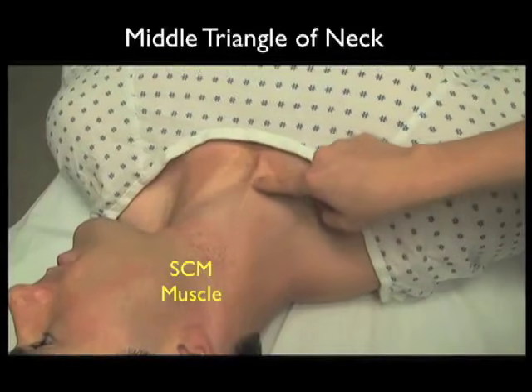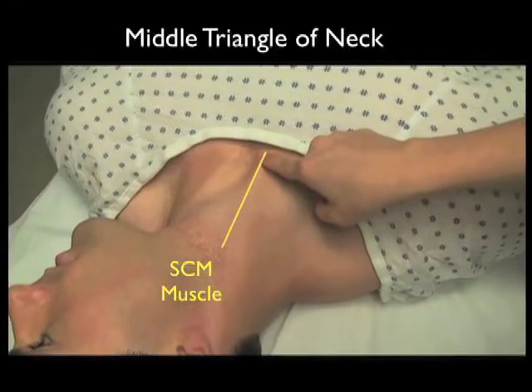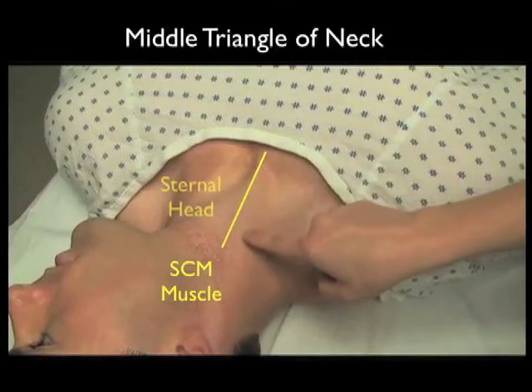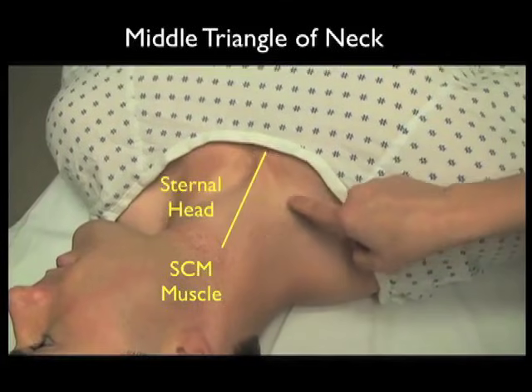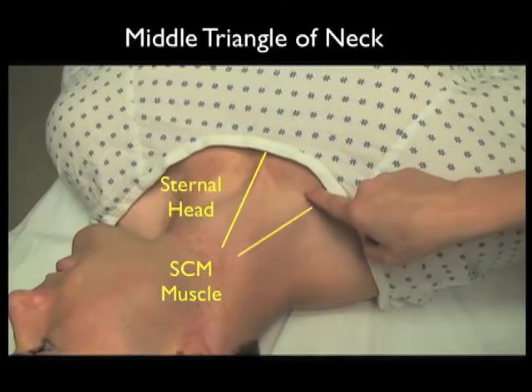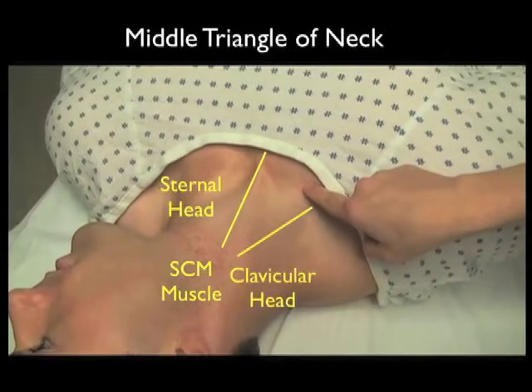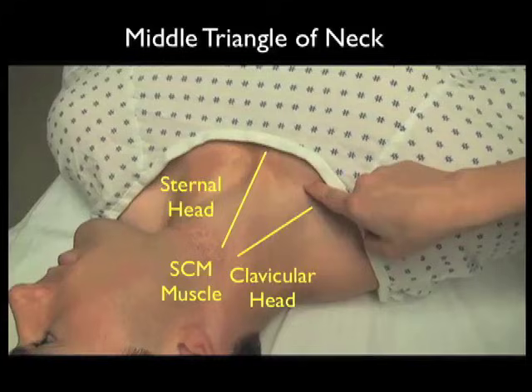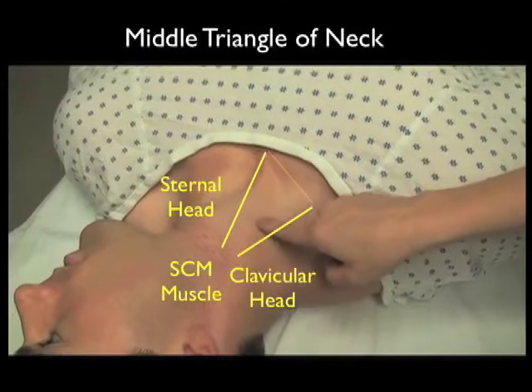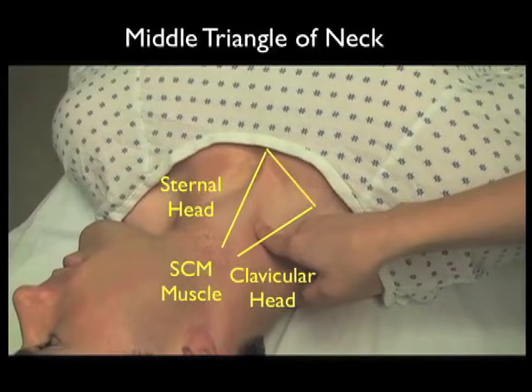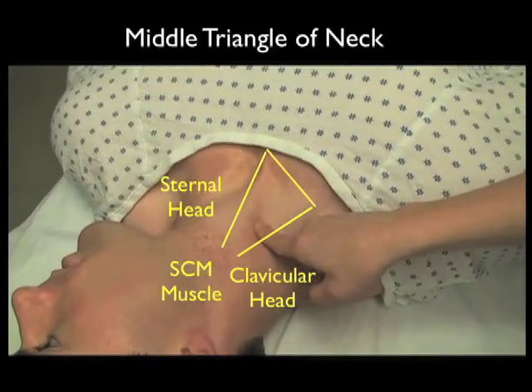Here's the middle triangle of the neck that serves as the standard approach for cannulation of the internal jugular vein. We see here the branches of the sternomastoid muscle — the sternal head medially and the clavicular head laterally.